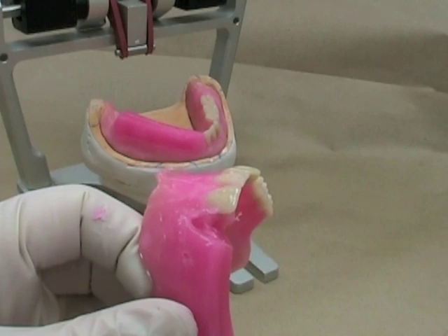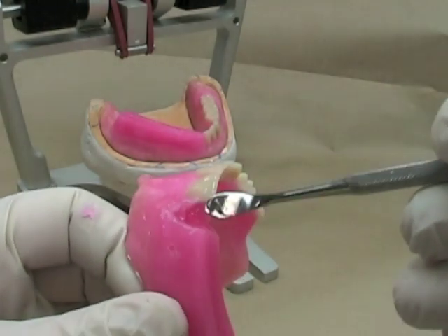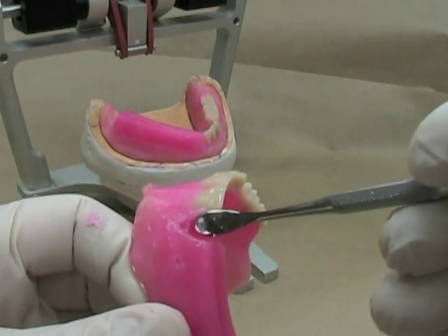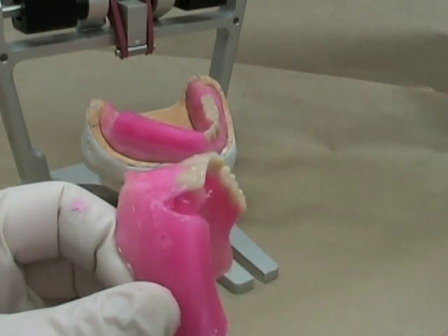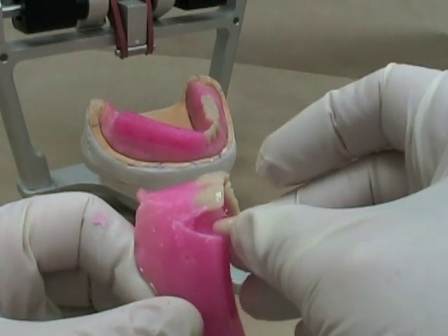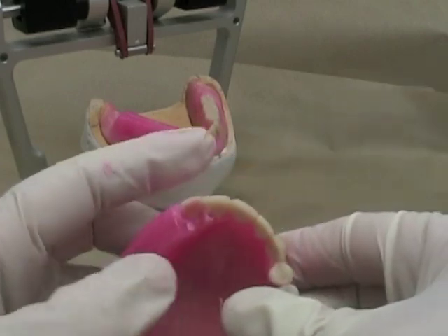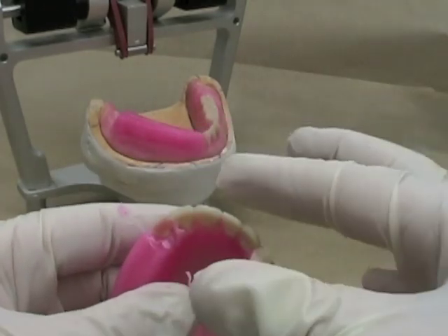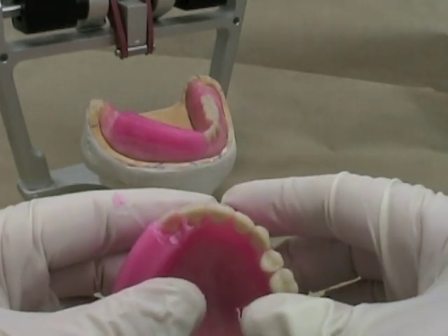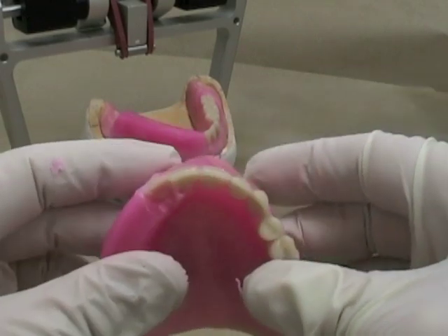Soften the wax, make it molten again, and set the lateral incisor. Remember: the incisal edge should be slightly — about half a millimeter — above the edge of the central incisor. The neck of the tooth should be depressed a little bit so it's not quite as prominent. Look from above and check the symmetry with the opposite side.